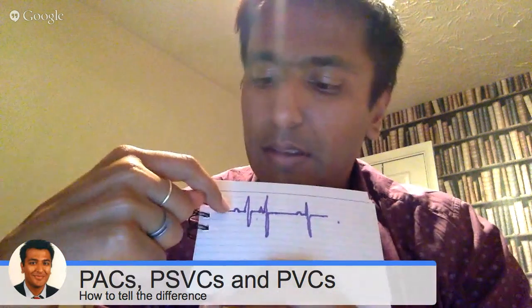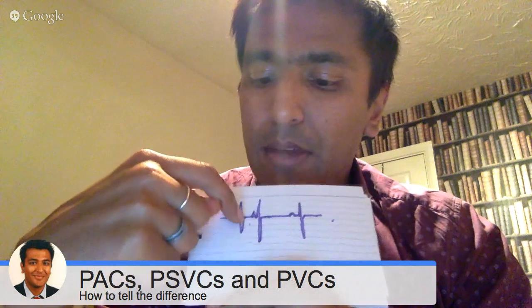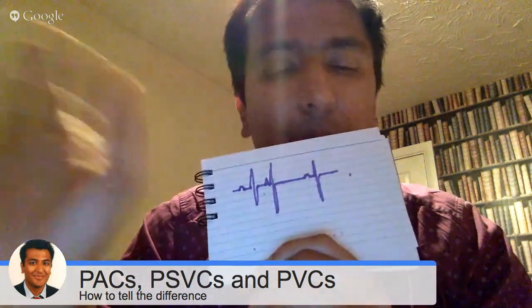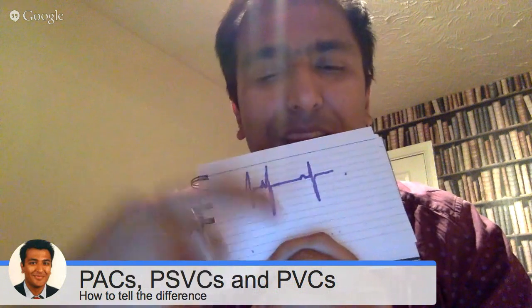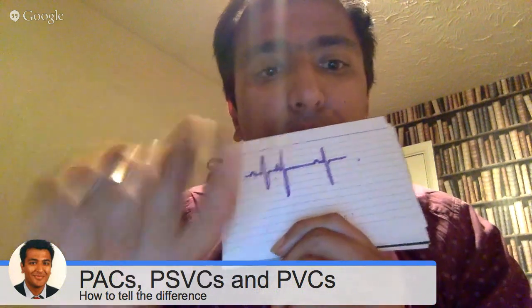Okay, so here we go. This is what a premature ventricular complex looks like. You get the drummer fires, and then suddenly someone else fires. Okay, so they're premature. If they occur late, then they're called escape beats. That tells you that there's something wrong with the pacemaker. He's not firing when the echo dies down, and something else then fires to compensate. Those are called escape beats. But PVCs, PACs, they're premature. So that's the first thing to bear in mind.